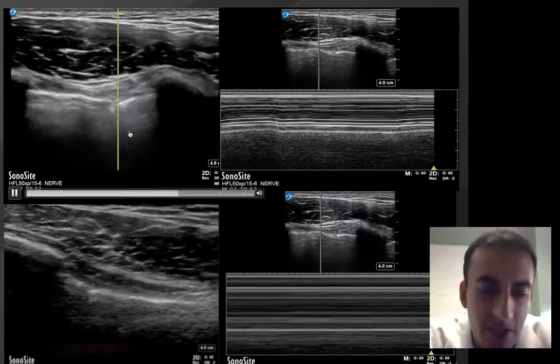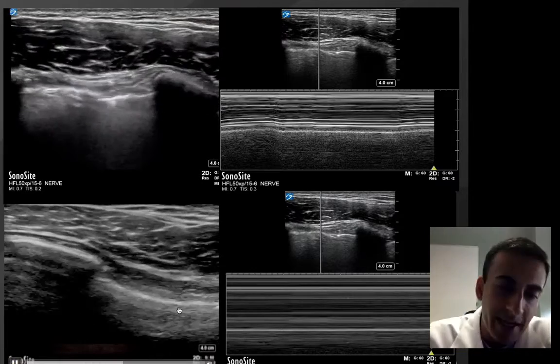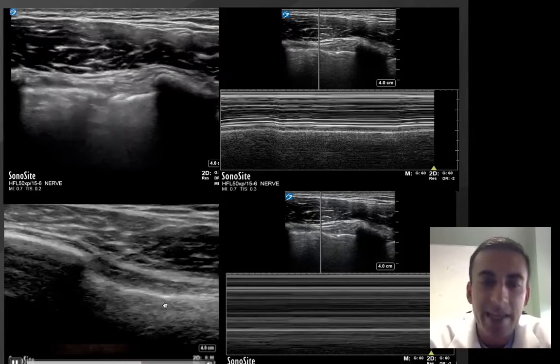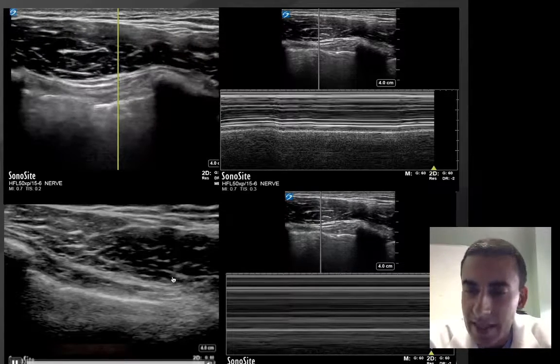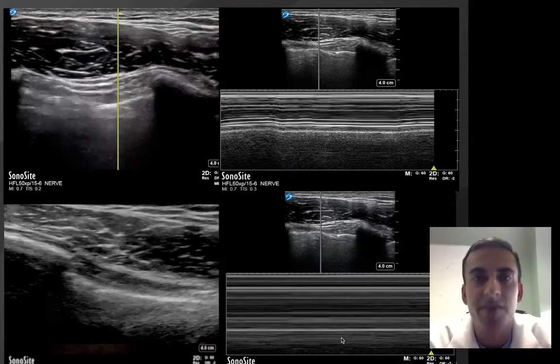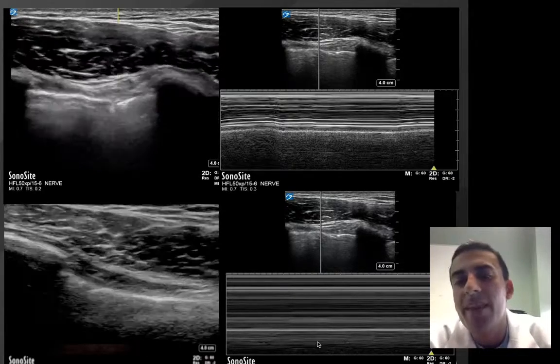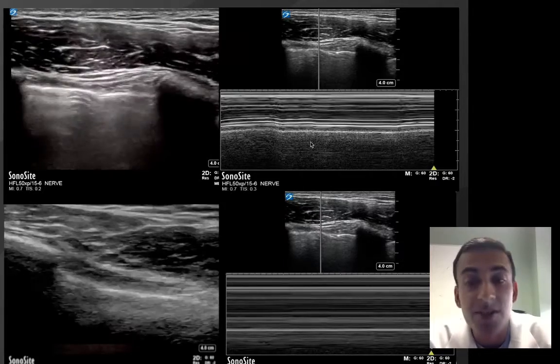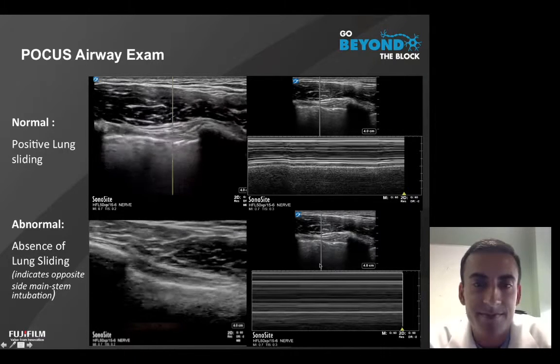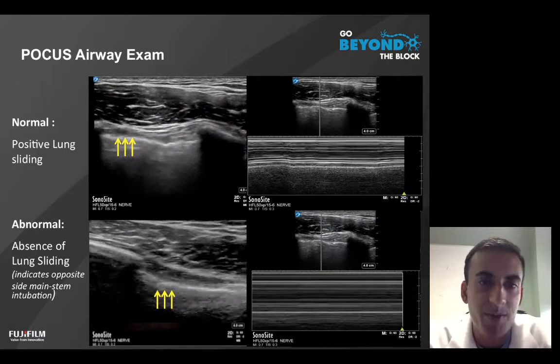Compare these top pictures to the bottom, in which we still identify this hyperechoic pleural line, but we are not seeing any sort of motion or sliding artifact. If we again use the M-mode modality, we can see that the motion artifact has disappeared, and what we see is the classic barcode sign, meaning that we show continued horizontal bands, not indicating any motion artifact because there is no motion, indicating absence of lung sliding. The focus again is on the lung pleura shown here.